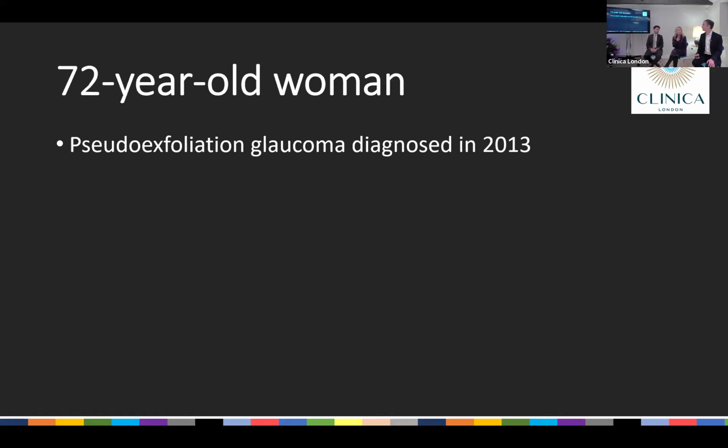Yeah, so definitely. So OCT scans are, as Anthony says, the new black. We look at the optic nerve head on color photographs now to see if there's disc hemorrhages, but it's really the OCT scan that we're going from for assessing the actual health of the optic nerve. And I was going to say something else, but I can't remember. Maybe it'll come back to me. I'll pass it to you.